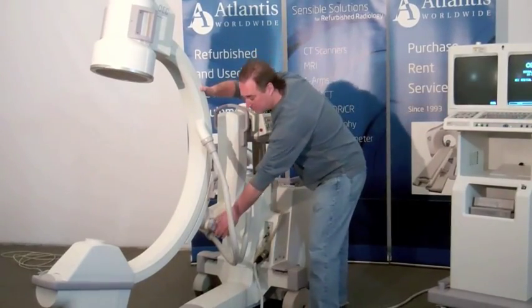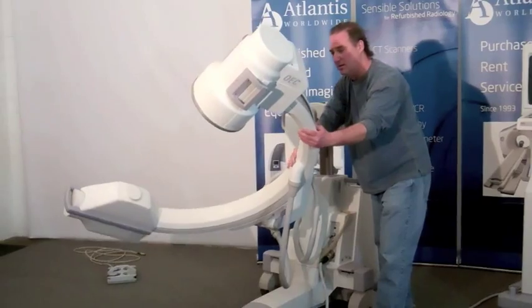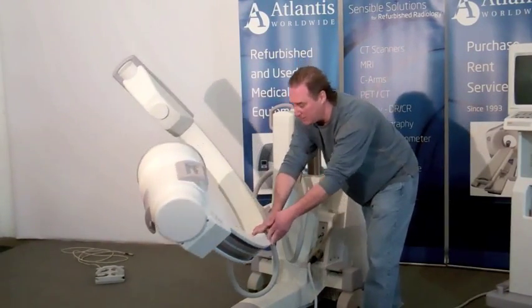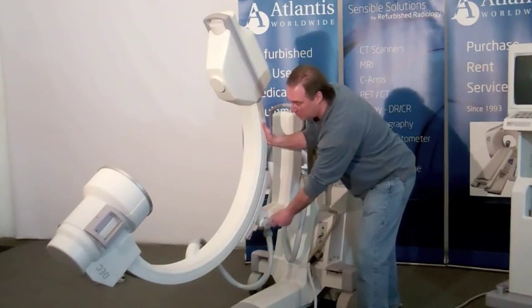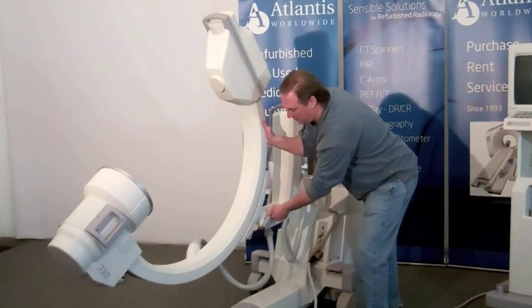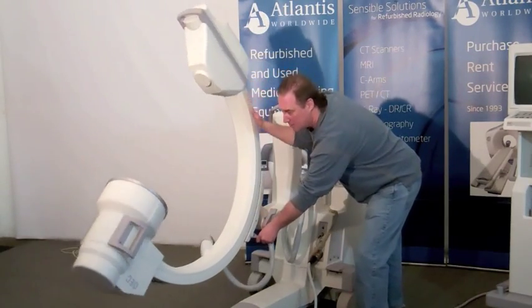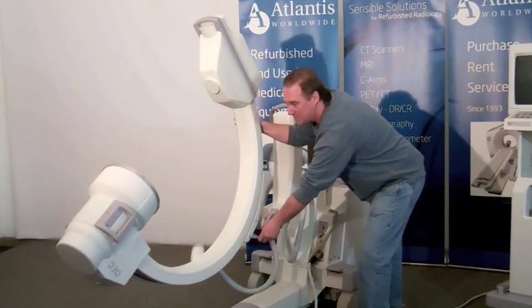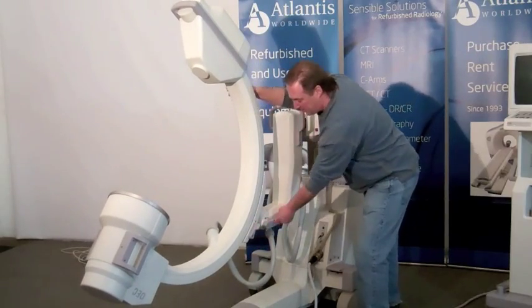The next aspect of the movements is this lever here, which will turn the C-arm left to right as you see it. So basically, you're able to turn the C-arm just about upside down, as well as sliding it as you see it. Once you get into the position you want, you can lock it in here and lock it in here.